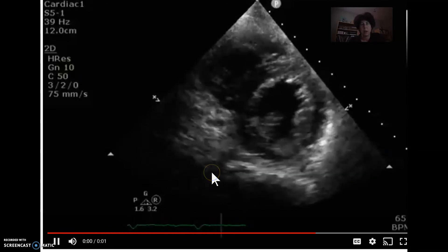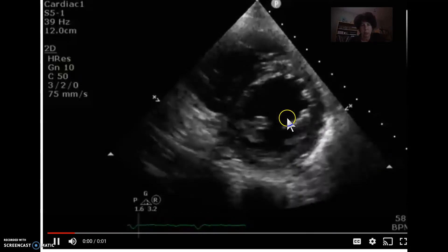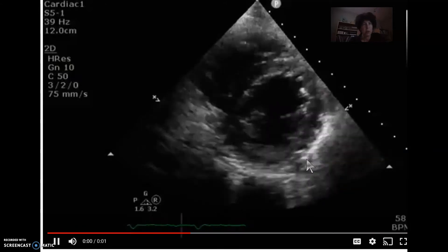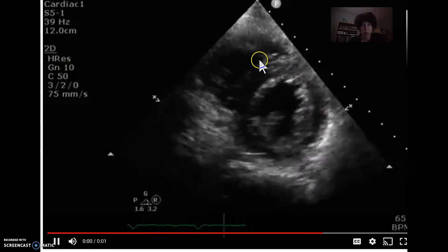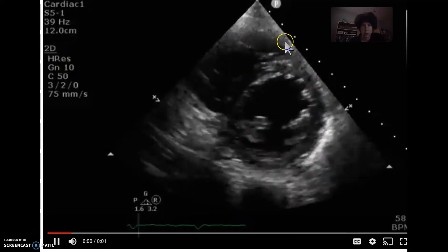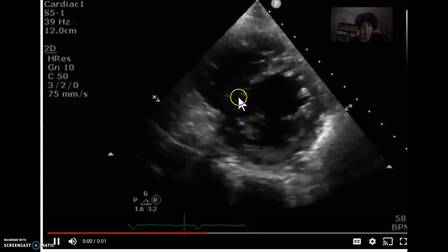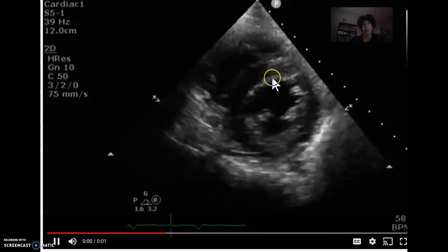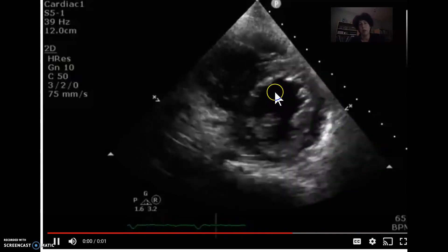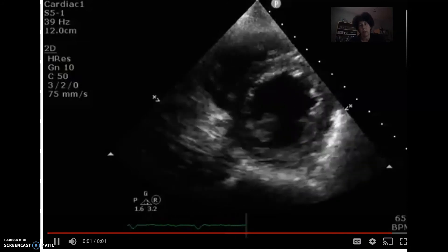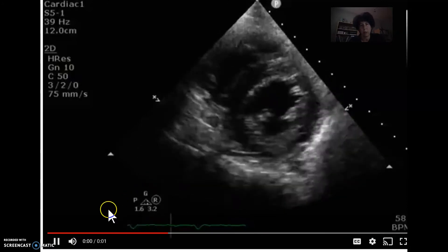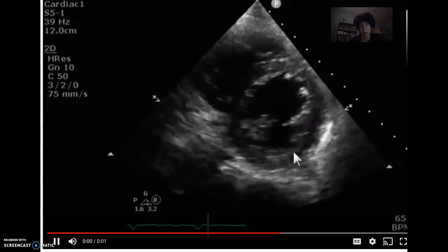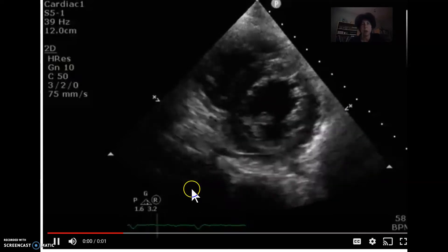Here we have a parasternal short axis in the mid-papillary view — nice round heart. This part seems to be going a little fast, maybe tachycardic. The right ventricle here seems a little on the larger side. You can see thickening in all areas, but eyeballing it, this ventricle looks like it's not contracting that well — some degree of hypokinesis and maybe a little dilatation. For sure this ventricle is not underfilled, so this is not a heart that requires a lot of volume.